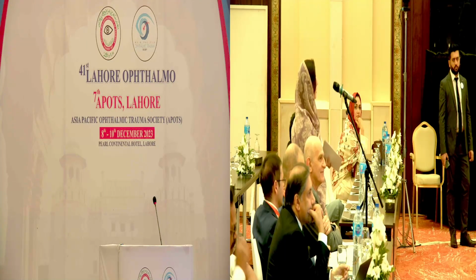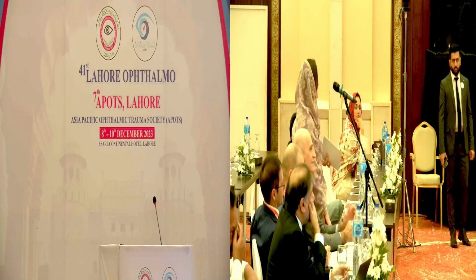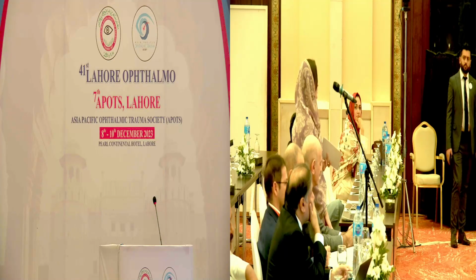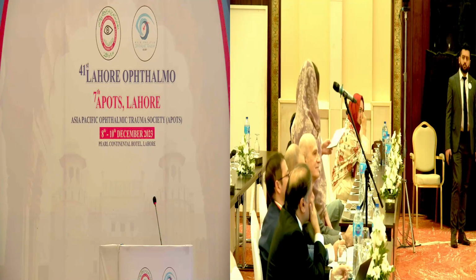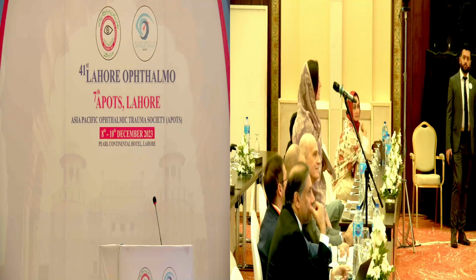I think you don't need phaco power in such patients because the cataracts are soft, they are not dense. So automated IA or manual IA can work here. And you use 350 millimeters of vacuum.